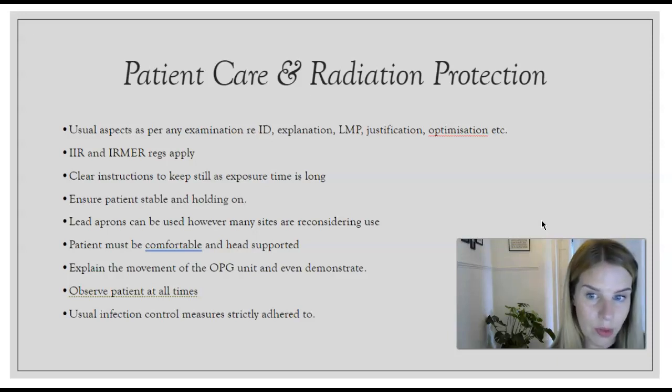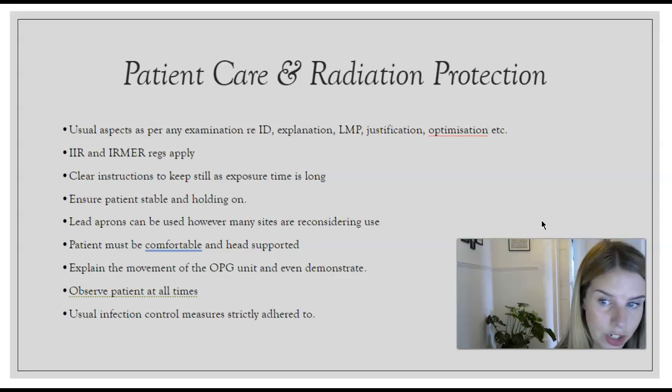You've given them all the information, you're telling them exactly what they have to do and that it's going to be over soon, just so that you can try and get the best image. But one of the main things is to tell them that the tube is going to move. Quite often people might forget to say that, and then the patient gets a fright because they're standing there, they're not expecting it to move around them, and as soon as it moves they jump, and then obviously the image won't be diagnostic.